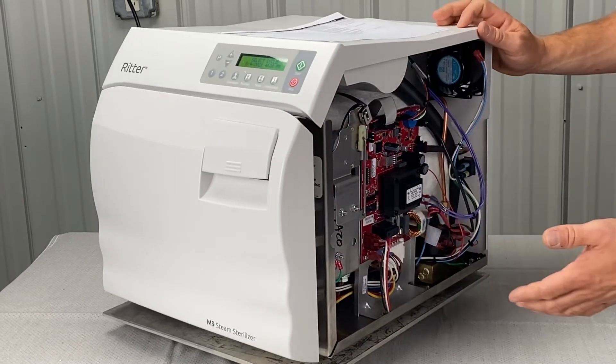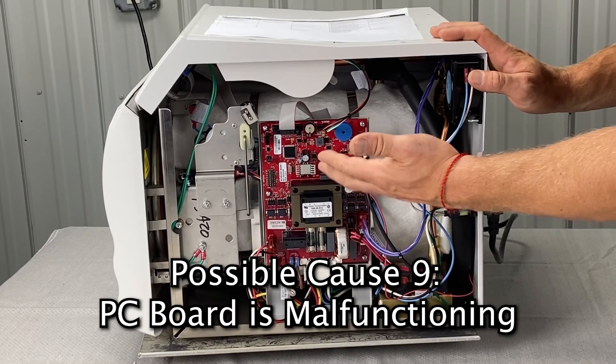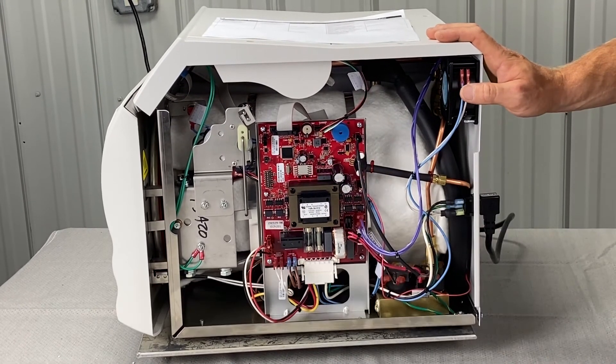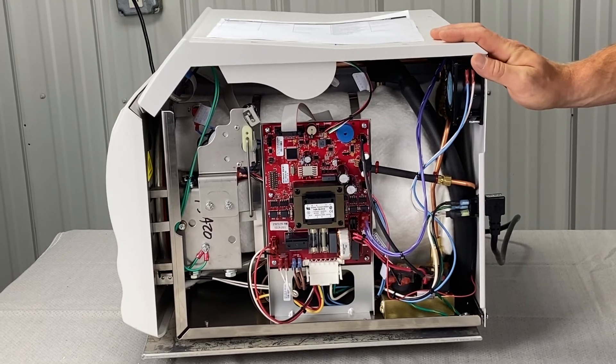If the heating element is good, then it could be a defective PC board — we can help you there. We do main PC board repair; you can send it in and we'll get it tested and fixed and right back to you.